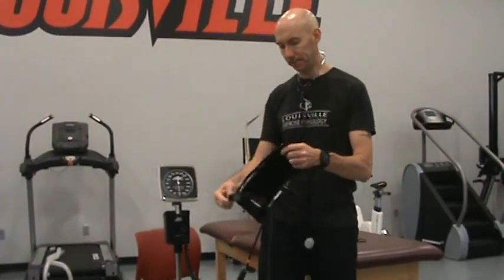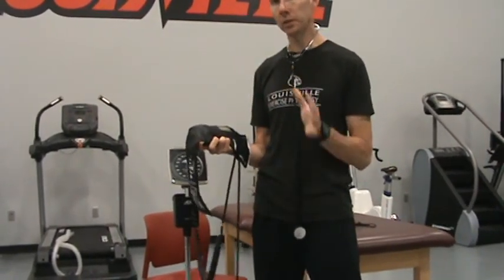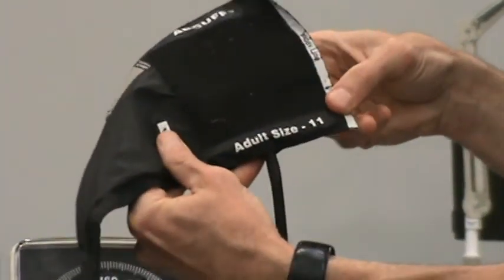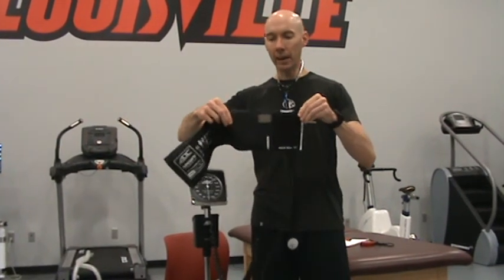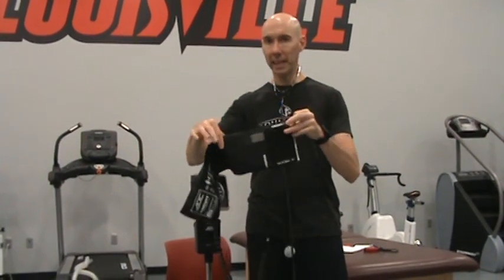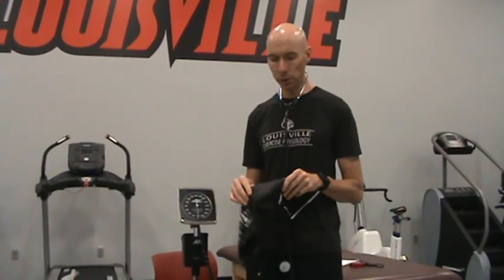This is known as the cuff. Cuffs typically come in three sizes, a child, adult, and a large adult. Notice that this one is labeled as an adult size. Basically, the reason there are different sizes is because you want to make sure the bladder of the cuff covers at least 80% of the arm. So even though this is very long, the bladder, what is actually going to pump up with air, is only this long. I want to make sure that the bladder covers 80% of my subject's arm when I put it on. If I have a larger individual, we would use a larger cuff. And in our lab, our larger cuffs are red in color, so that's a pretty easy way to differentiate them.